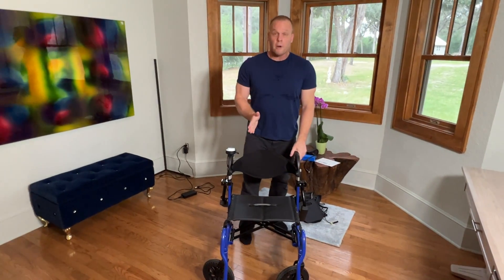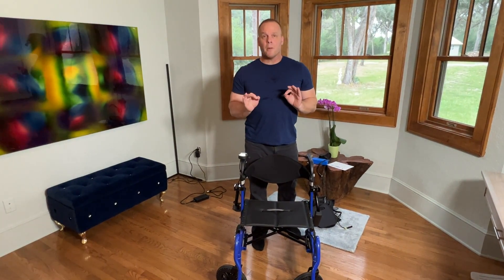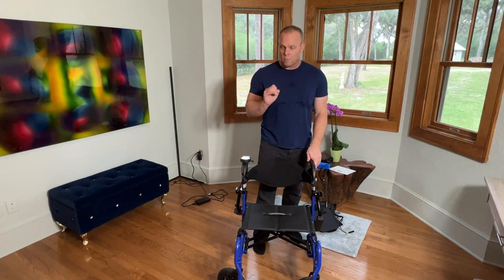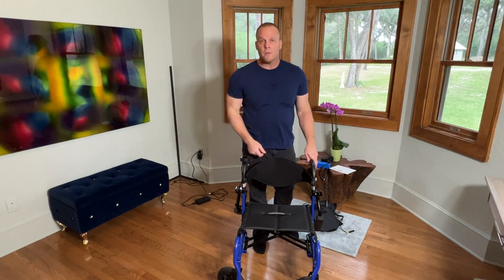So it's great for when your doctor tells you you need to keep on walking. You want to keep on walking but you also want to have confidence to know you can take a break and use a power foldable wheelchair like that when you're ready.